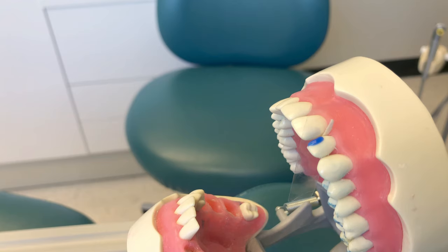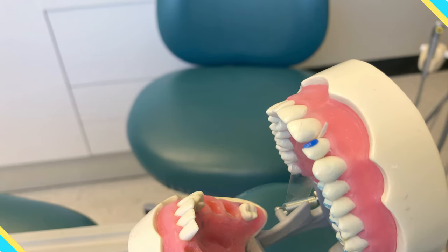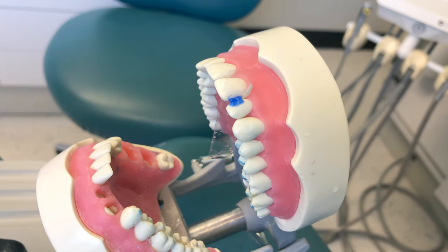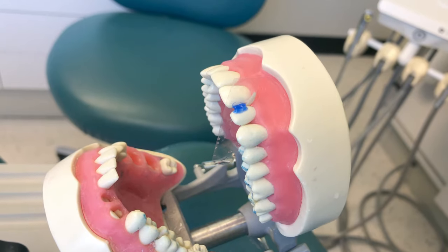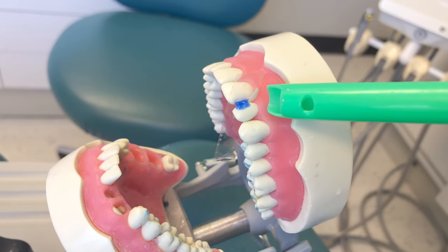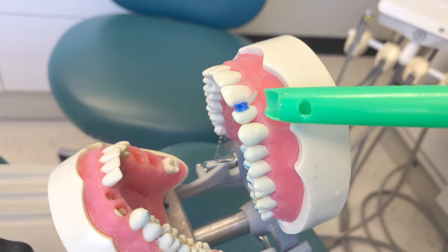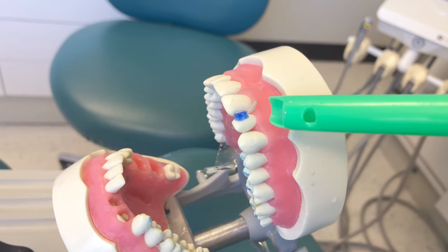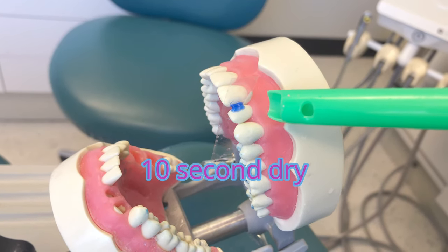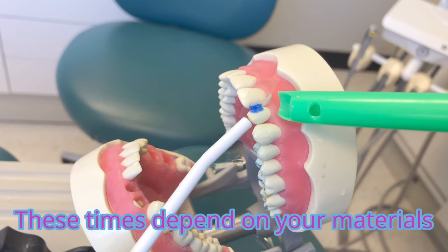This conditioner needs to stay on the teeth for 20 seconds. After your 20 seconds are up, we're going to suction up the bulk of the etchant, then rinse for 15 seconds and dry for 10 seconds. So it's a 20-second etch, 15-second rinse, and 10-second dry. Keep your HVE near the tooth during the whole procedure.